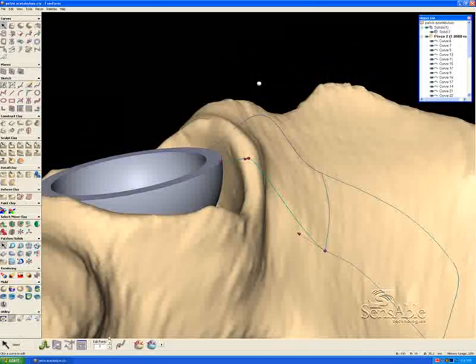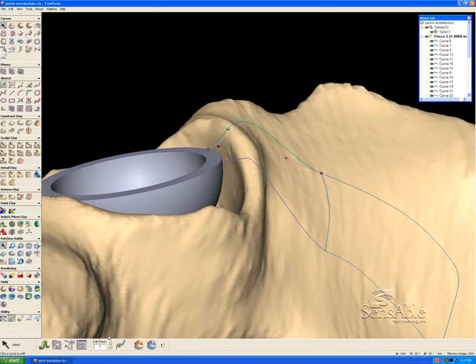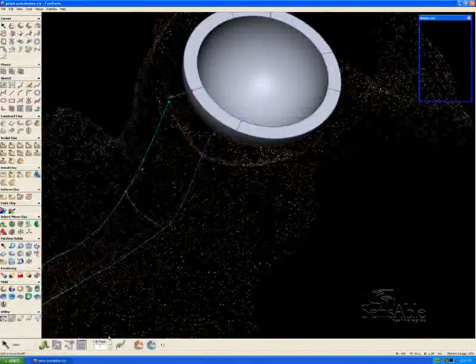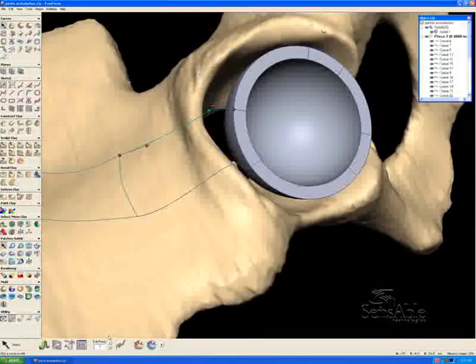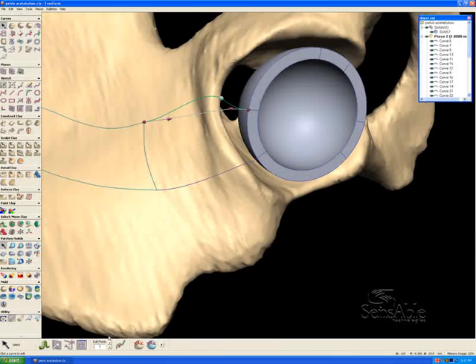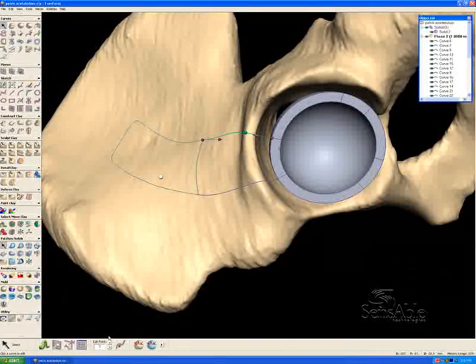What I want to make sure is that I give enough room around the acetabular periphery so that in the operating room, anything that's been changed using the ball-shaped reamer to dig out any adjacent bone material, anything that's changed from the time that the scan was taken, won't be affected. That's why the area of the tabs that's fitting to the clay is actually down here on the pelvis.